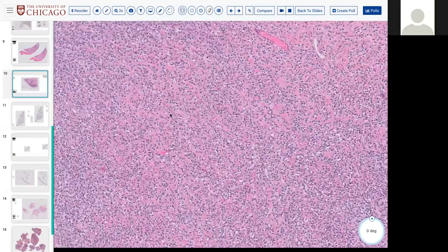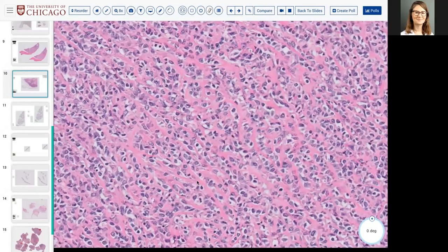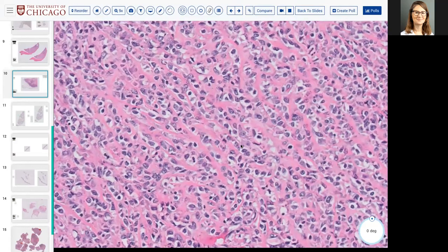I guess this doesn't look at all like a melanoma, but just maybe. Absolutely. No, these are all great thoughts, and the problem is you kind of have to do all of them, right? So if you are thinking about a melanoma or a PEComa, you can have clear cell change in PEComas. Absolutely, you'd want to think about your melanocytic markers. In this case, it would be negative.